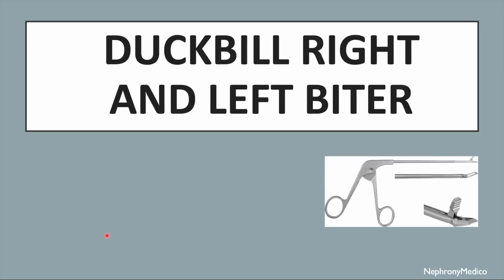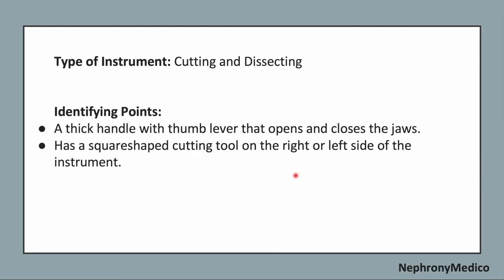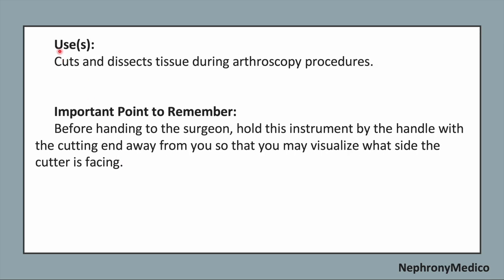Let's talk about duckbill right and left biter. This is a picture showing duckbill right and left biter. It is a cutting and dissecting type of instrument. Now, identifying points. A thick handle with thumb lever that opens and closes the jaws. It has a square-shaped cutting tool on the right or left side of the instrument. Use. It cuts and dissects tissue during arthroscopy procedures.